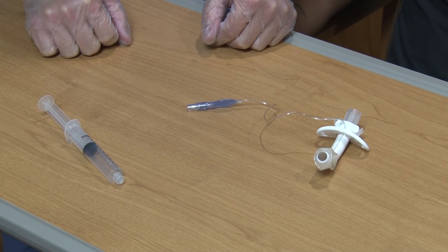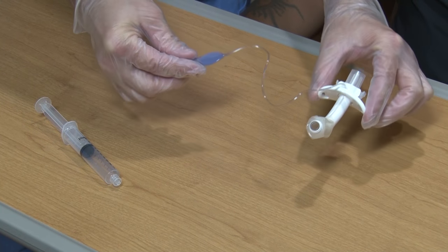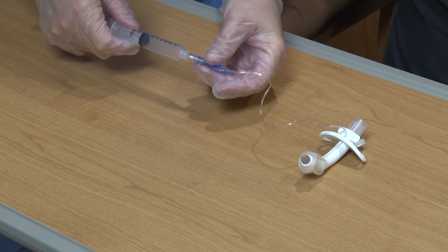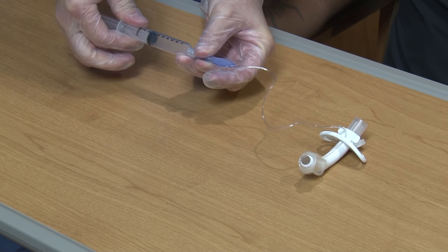The outer cannula is the main part that actually sits inside your airway. It stays in place by the neck plate and trach ties.